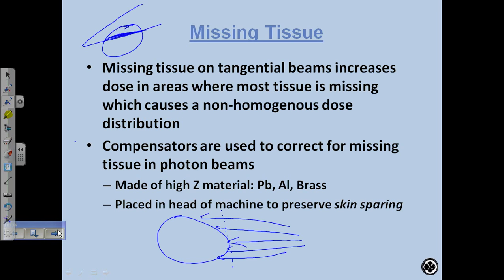Okay, well, I'm saying a lot of things here. Skin sparing, that's a new term, right? Well, it's not a new term. Is it a new term, skin sparing? It's not. You guys know what skin sparing is, right? What's skin sparing? Skin sparing is, okay, skin sparing is the buildup effect.